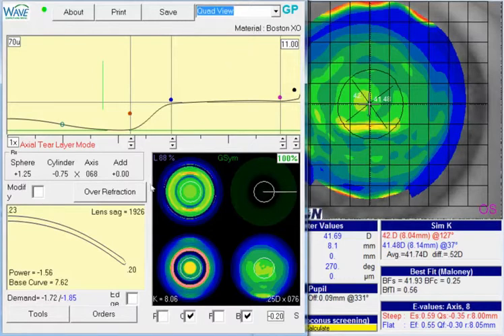Especially if this is going to be a monovision correction for one eye, we need to increase the sensitivity and increase it by about 2 diopters. So our new target will be about minus 3.56. We already have the blending turned off and some asphericity in there, and I think we can even go to one.